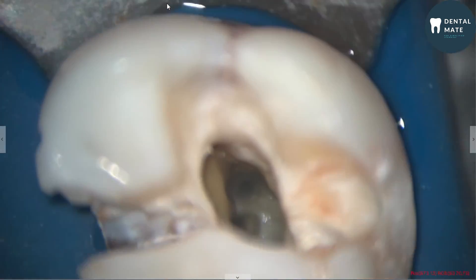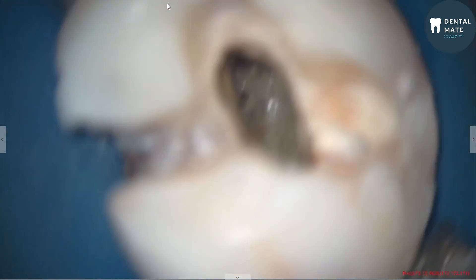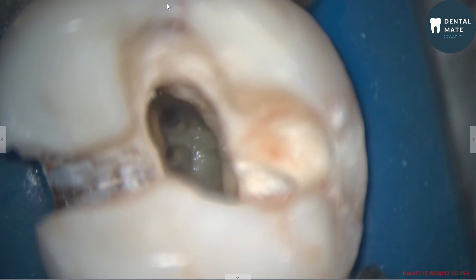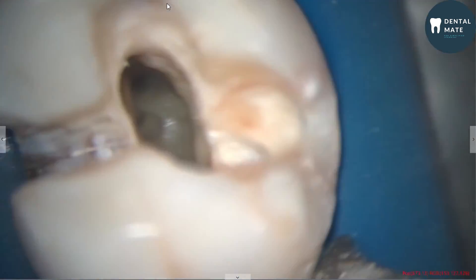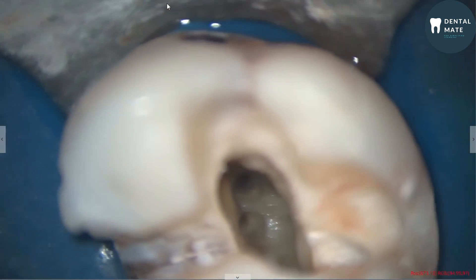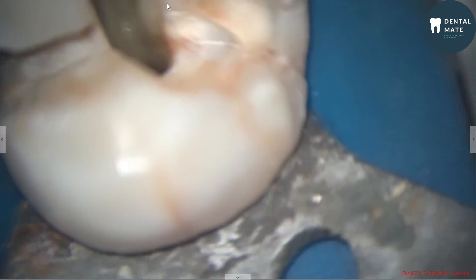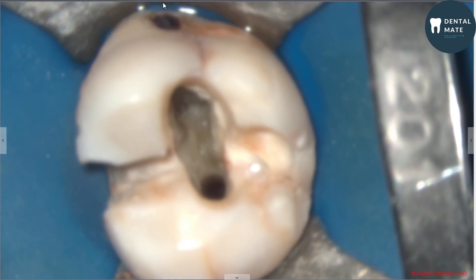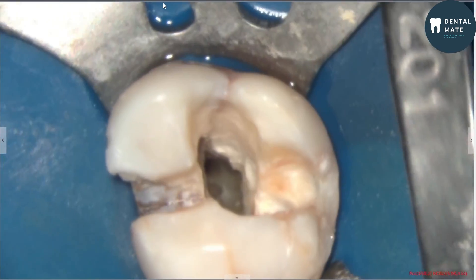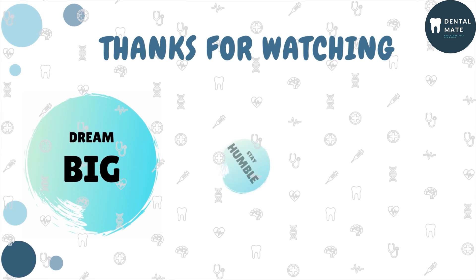Here are the two mesiobuccal canals — MB1 and MB2. This is the distobuccal canal, and this is the palatal canal. We have now located four canals in this maxillary molar: MB1, MB2, distobuccal, and palatal canal. With this I conclude this topic — do let me know in the comments if this video has helped you. Thank you from the bottom of my heart for all the love and support. I wish you all happiness and success in life.